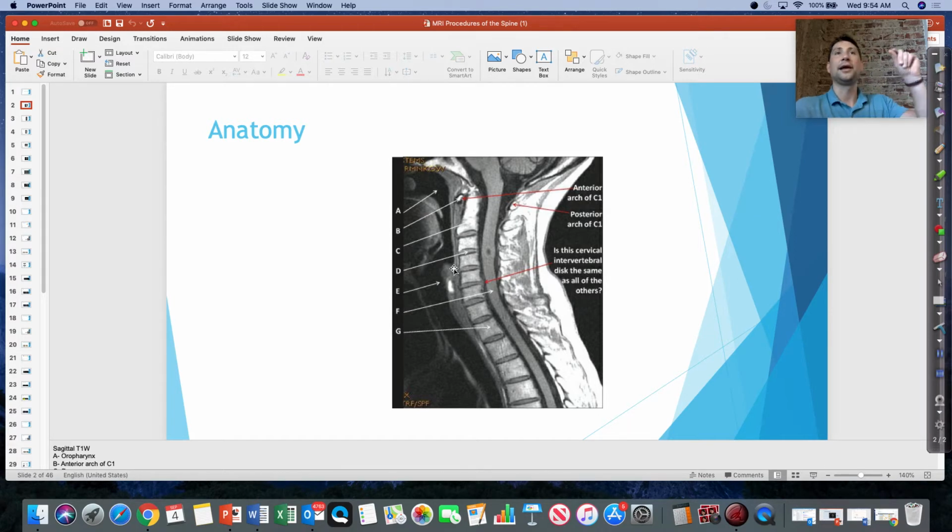But there's also a button on your GE scanners that can reduce the intensity of the signal on your phased array coils, and that's the SCIC on your GE scanner. If you have that button, it's to suppress the signal intensity right near the coil. So SCIC on your GE scanners helps to even out that high intensity closer to the coil.